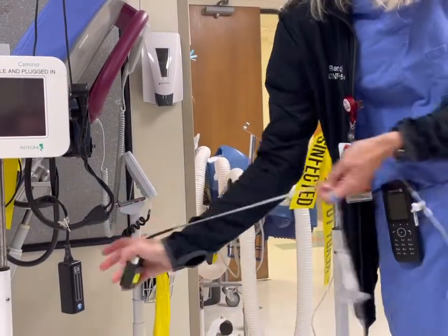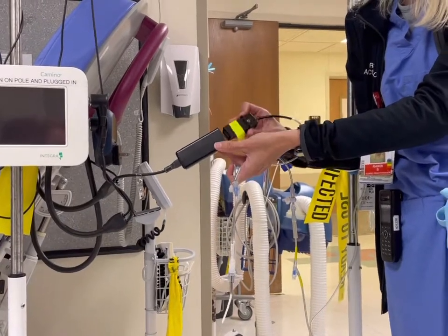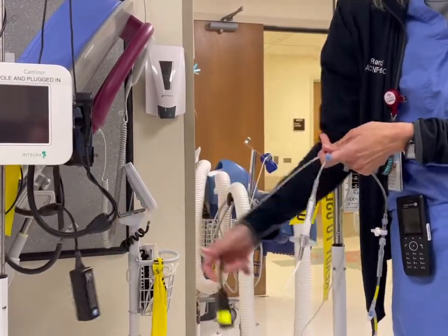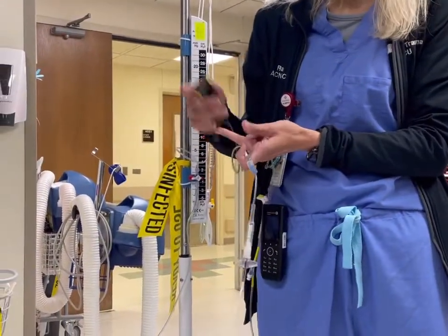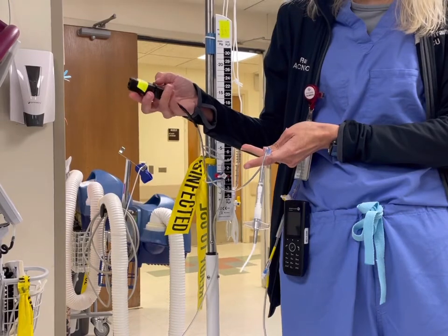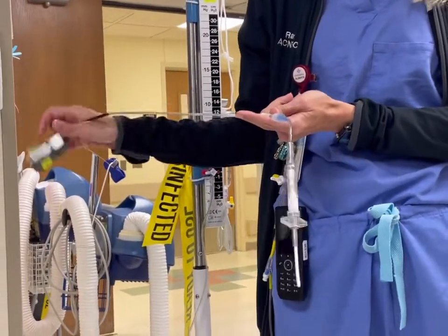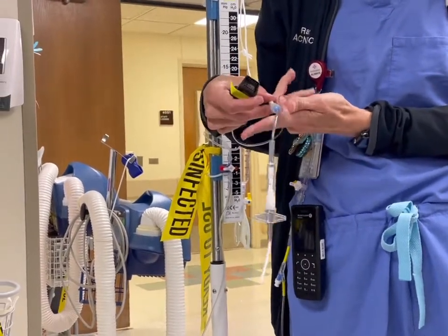This also can disconnect when you go to CT scans and to MRIs. Basically, this won't interfere with anything. You just disconnect there and it should be leveled. When you put the bolt in, the neurosurgeon usually levels it when it's placed, so you don't have to worry about anything unless you get weird readings, or there's a little metal part in the tubing that, if that comes dislodged, or any part of the bolt system comes dislodged, you want to let the neurosurgery team know, and they'll have to come back and re-troubleshoot it.